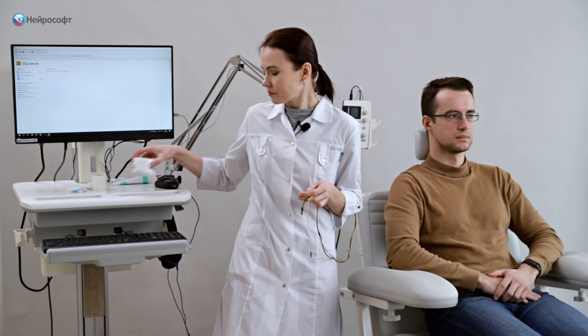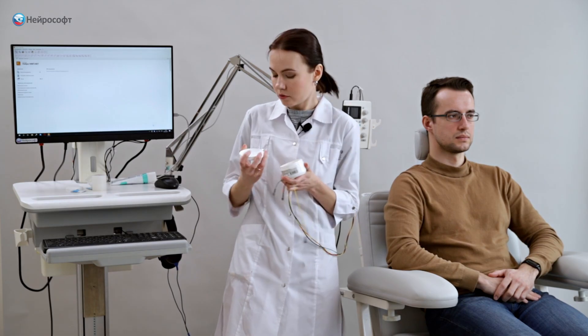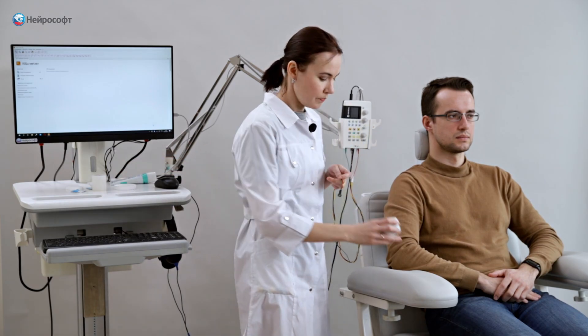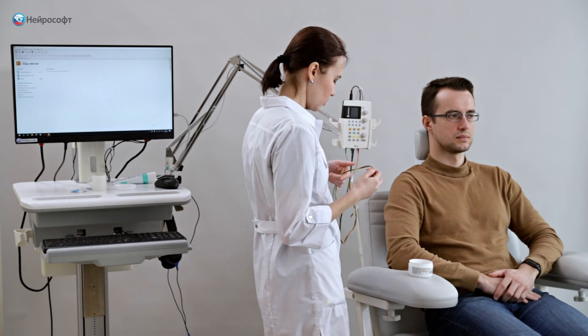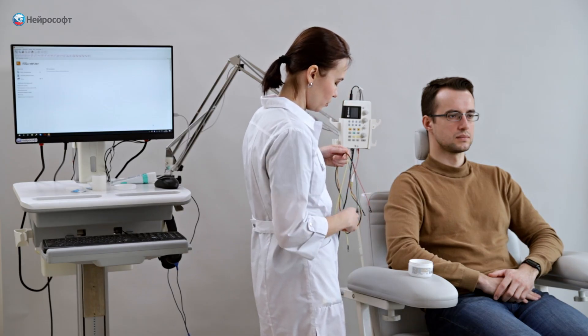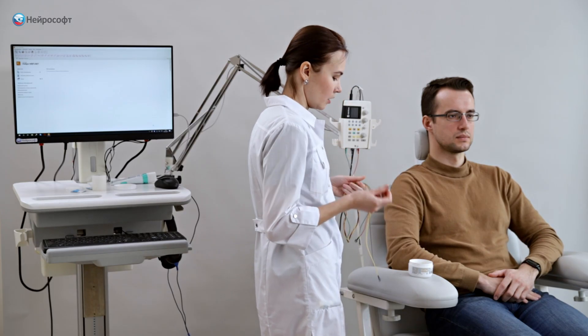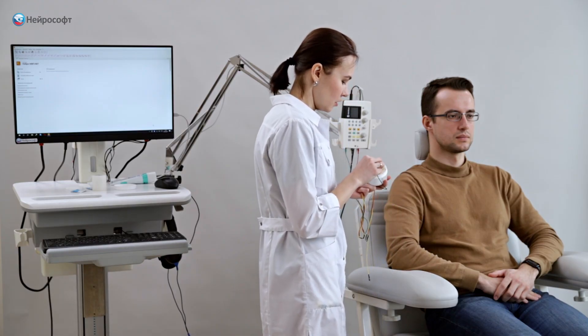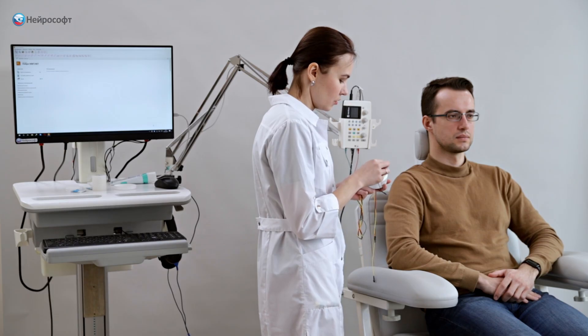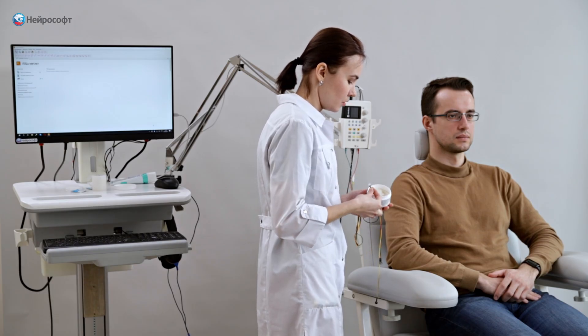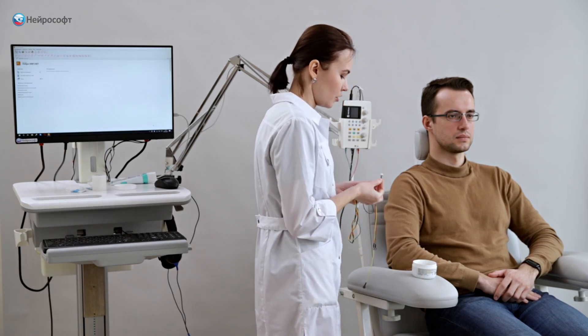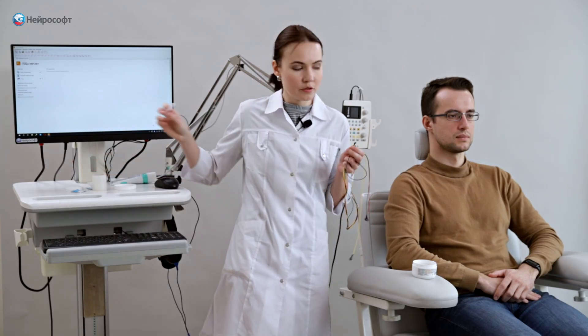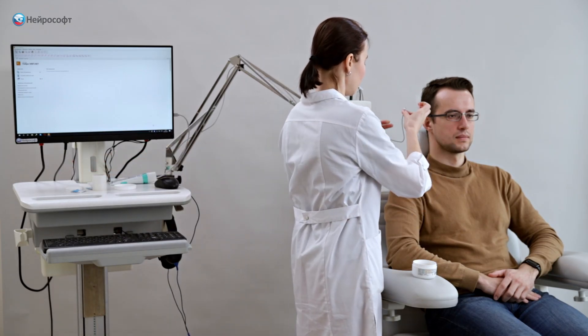They are already connected to the EMG device respectively to the first and second minus channels. In order to fix the electrodes on the skin, we use a specialized adhesive conductive paste. The first channel is applied to the left mastoid. We use a cup electrode filled with paste. For fixation on the skin, we use a medical tape.